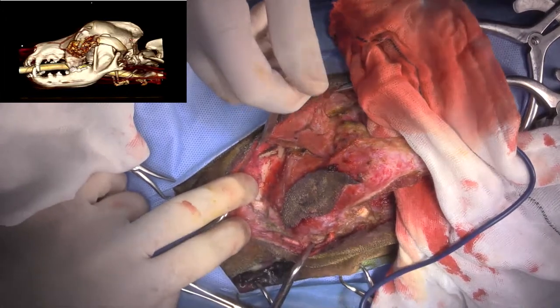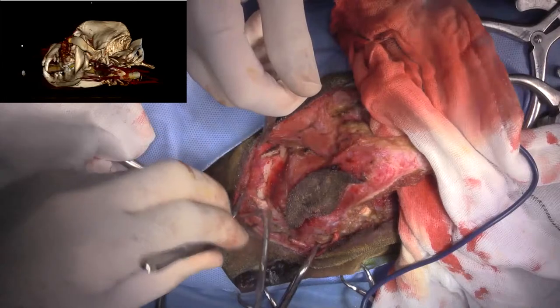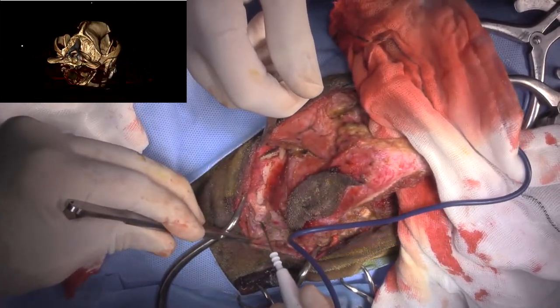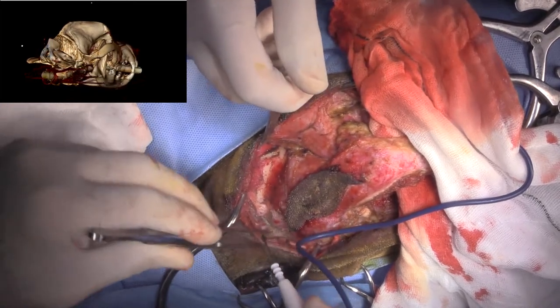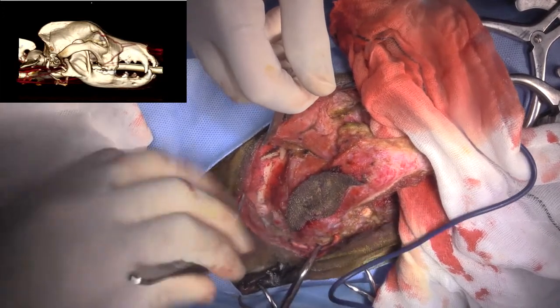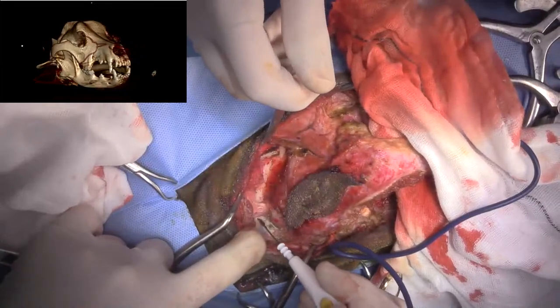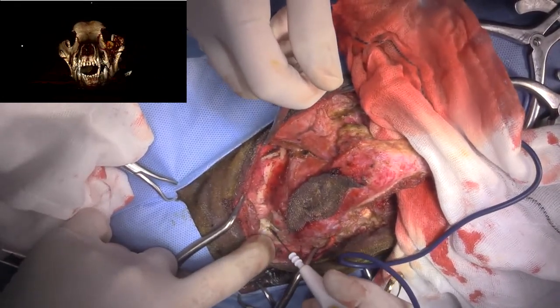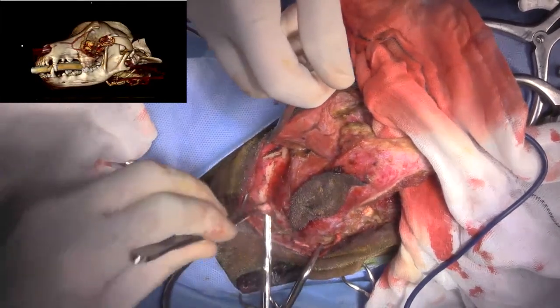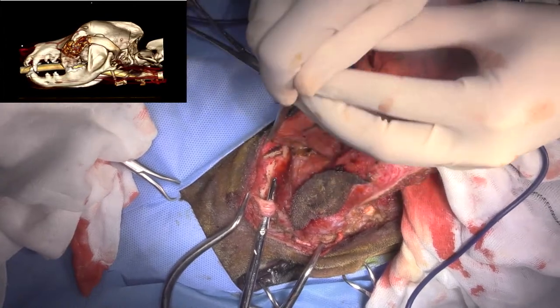So that's the infraorbital nerve bundle right in here. Can we get some mepivacaine, please? Yeah, mepivacaine. So that's the infraorbital nerve bundle right here. And so I'll inject that with mepivacaine before I cut it.